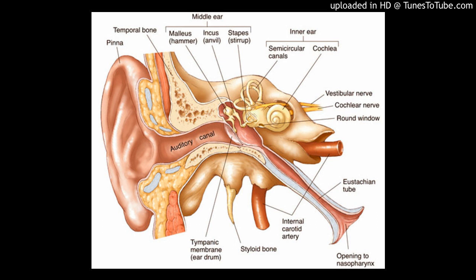It removes a large surface onto which cholesteatoma may be adherent. It removes a barrier behind which the cholesteatoma may be hidden. It removes an impediment to the introduction of instruments used for the removal of cholesteatoma. Thus, removal of the canal wall provides one of the most effective strategies for achieving the primary aim of cholesteatoma surgery, the complete removal of cholesteatoma.